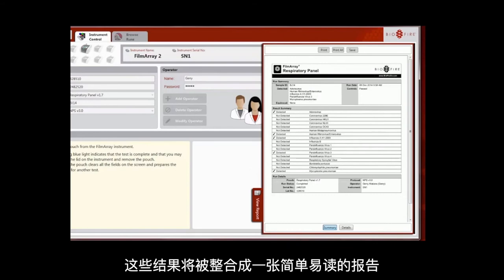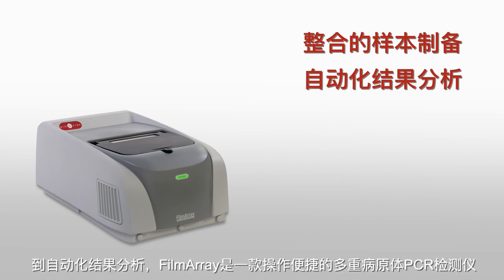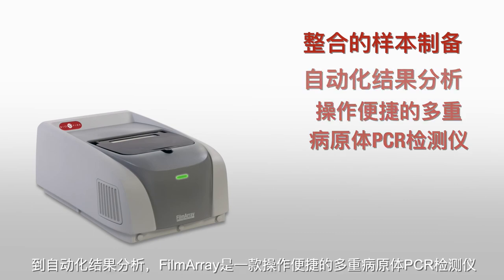These results are provided in one easy-to-read report. From integrated sample preparation to automated result analysis, the FilmArray is user-friendly multiplex PCR.